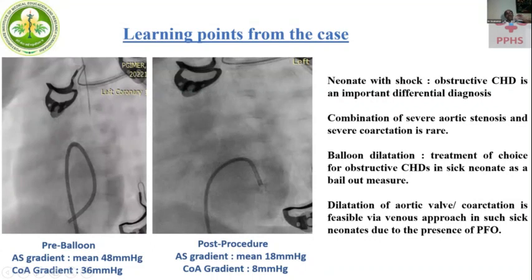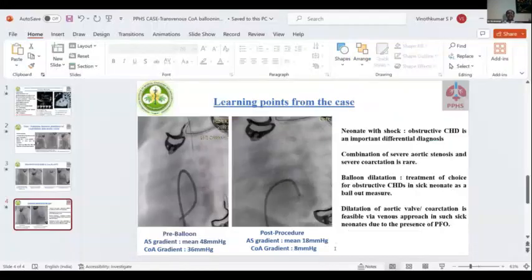Dr. Shaka, this is an interesting area. One of the problems with this transvenous approach is that the guide wire may go through the anterolateral papillary muscles of the mitral valve, and then the balloon goes in. Sometimes we recognize post-procedure that there is a mitral valve injury, chordal injury, with some mitral regurgitation. Any tips on how to avoid such a thing happening?